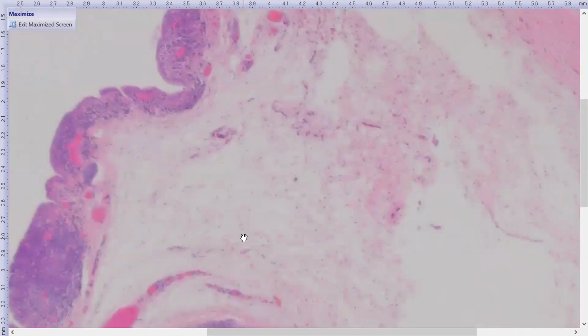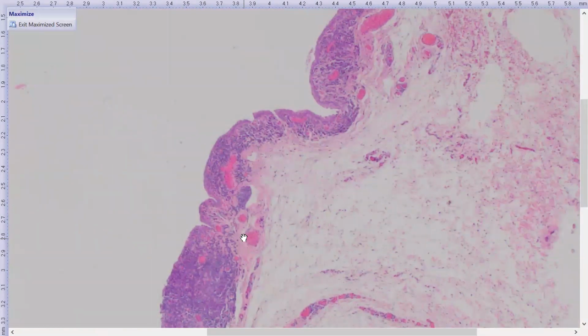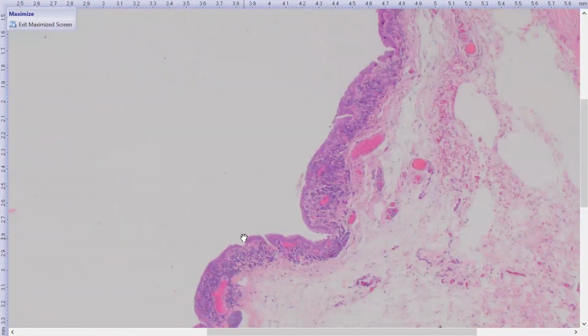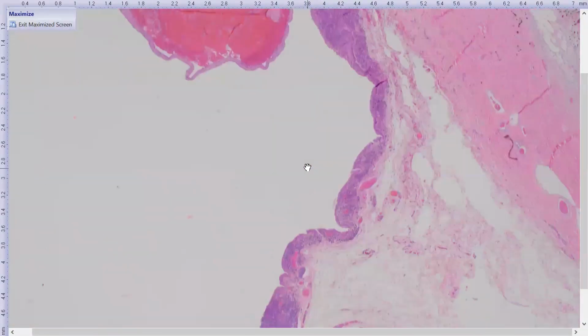It's really close. Okay. It's just a lot closer on the screen than in scope. Okay, so here's, ooh, we'll do there. Okay, that'll be good.